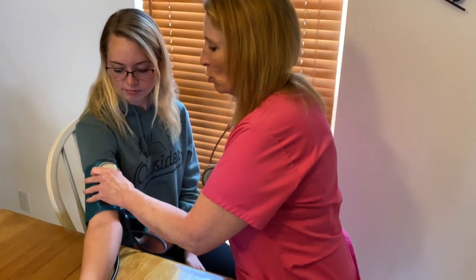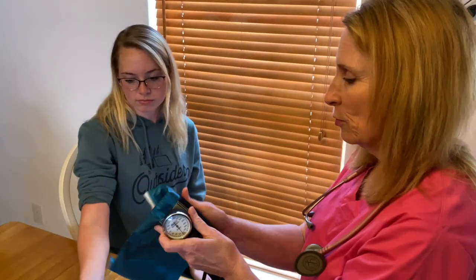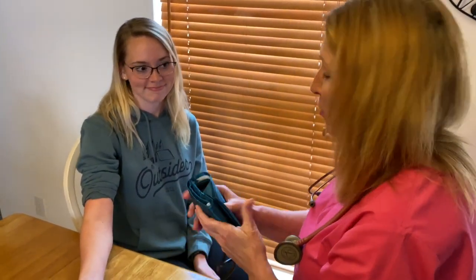I'm going to remove the cuff and thank my patient. Thank you, Sarah. You're welcome. And then I'm going to document.